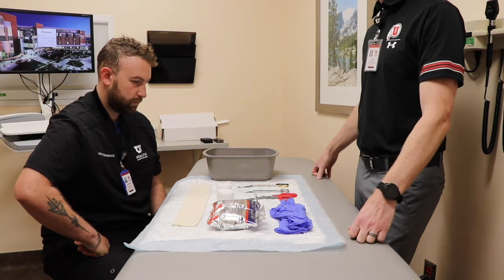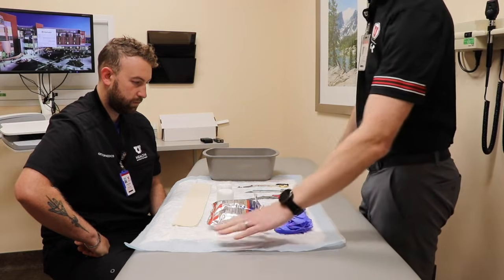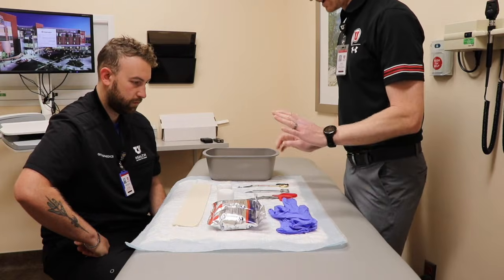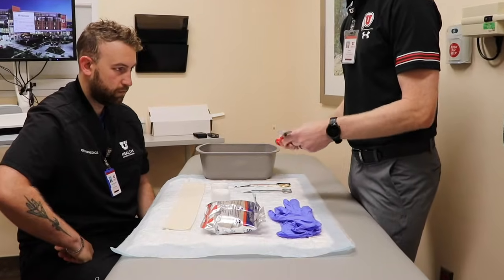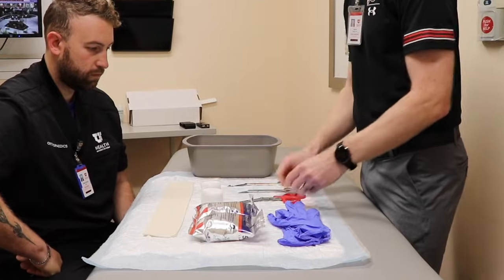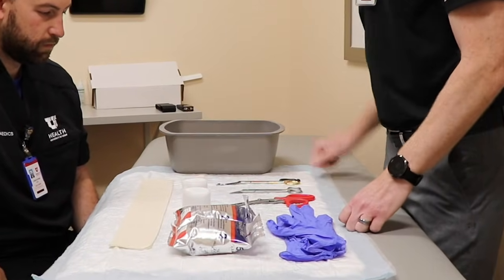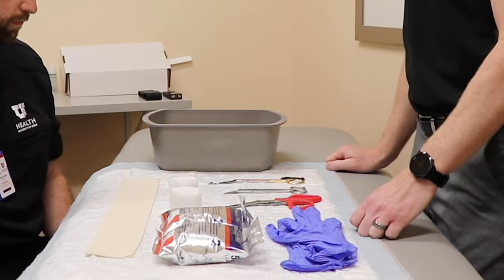Here are our supplies that are needed. We like to use one of these chucks just to keep things clean since this is a messy kind of procedure. Got a set of gloves, a bunch of different scissors. It is highly recommended that you have specific casting scissors because the casting tape does tend to screw these things up. Two rolls of casting tape, two rolls of padding, and then the stockinette for the arm as well as the thumb. And we got some water here as well to help with molding.